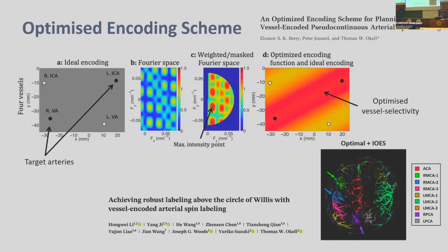This approach is still under research, requiring input from the operators. But hopefully the current progress of AI-based methods will help us implement more user-friendly, robust, or maybe even completely automated planning methods on the MRI scanner, so that radiographers do not need to worry about the planning.